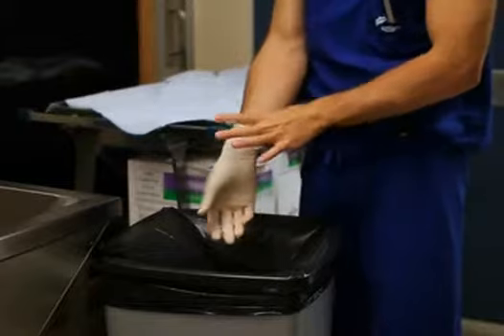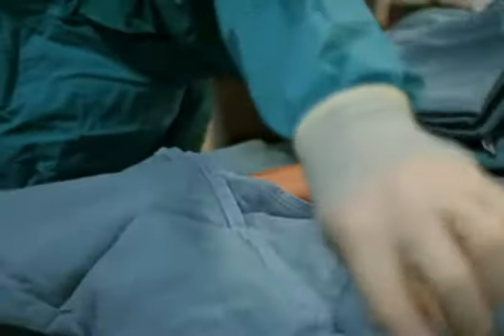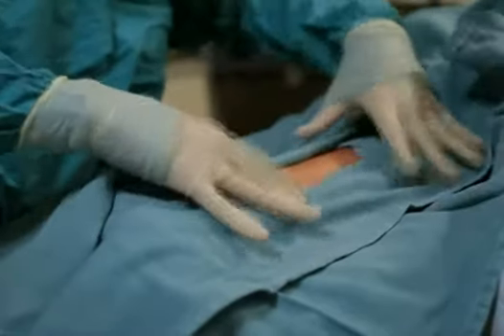Discard the gloves. Wash your hands again and put on the gown and a new pair of sterile gloves. Drape the patient, exposing only the cleaned forearm from the wrist to the antecubital fossa.